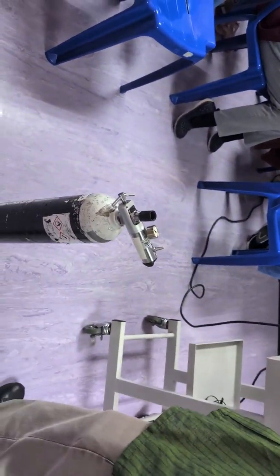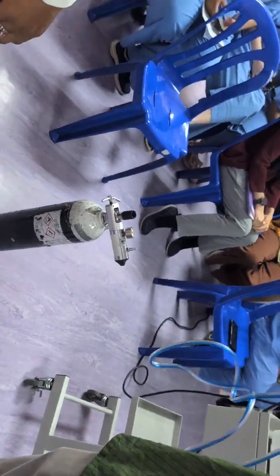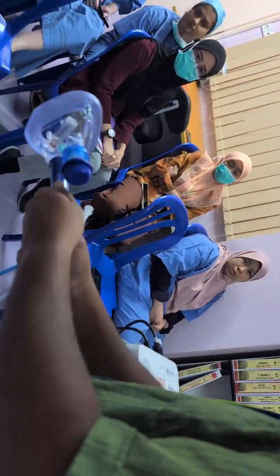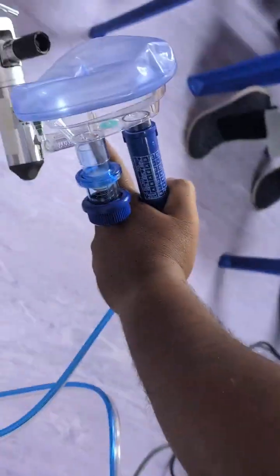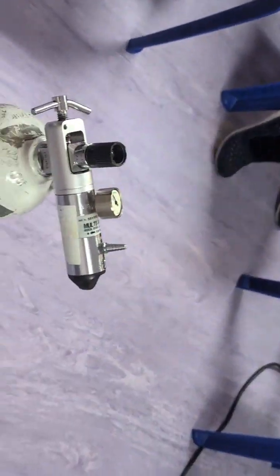This is a venturi. Venturi is noisy. There is A and B. A is the blue, B is the white. A is the venturi and B is after the venturi. Now, they are saying here for 40% FiO2, A open to 7, B open to 10. I don't have a double flow meter, but I have got one. This will work very well for pre-hospital care.